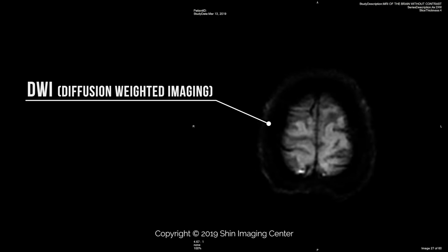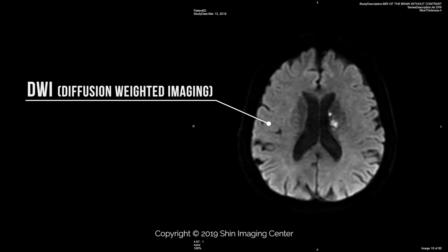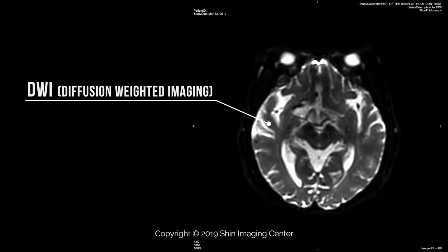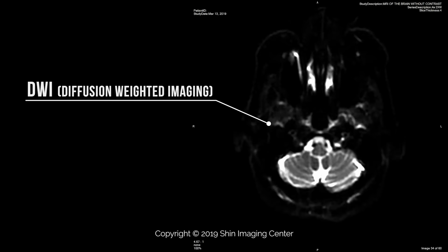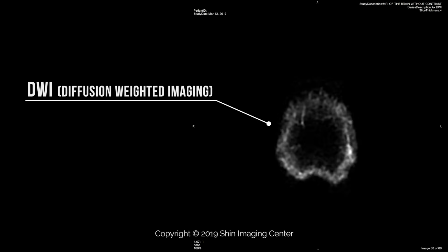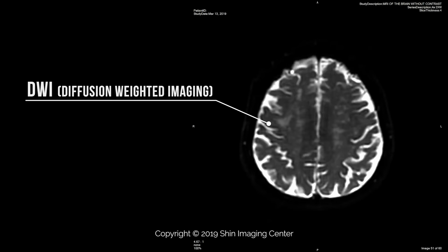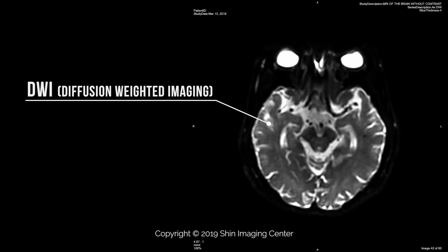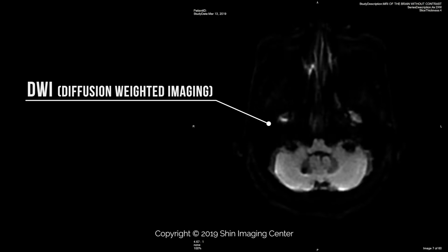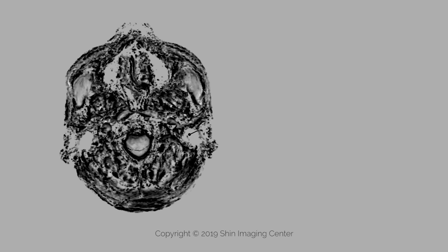Diffusion-weighted imaging, or DWI, should not be confused with the more advanced technique of DTI. Diffusion-weighted imaging is the most basic technique of measuring the relative diffusion or free flow of fluid in various parts of the brain. Developed in the 1990s, it remains a useful component of a total imaging strategy for diagnosing traumatic brain injury. At Shin Imaging Center, DWI is considered a standard sequence we employ in all brain MRIs.